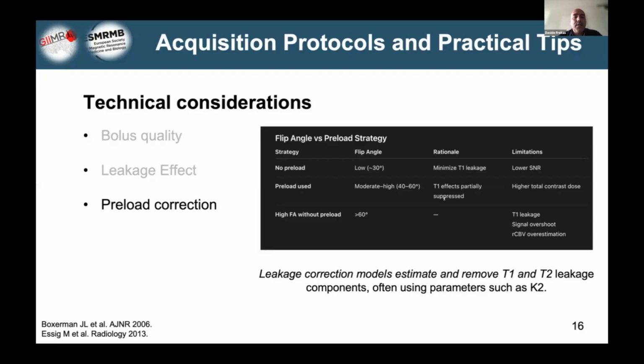The flip angle is also an important parameter to adjust with this strategy. When no preload is used, the flip angle should be kept low, typically around 30 degrees.